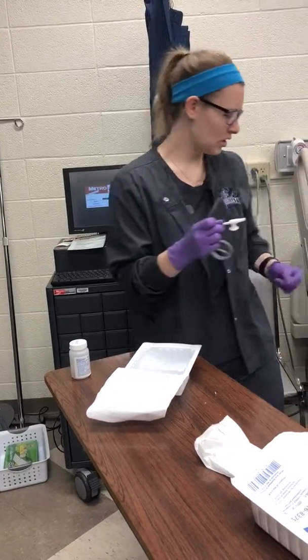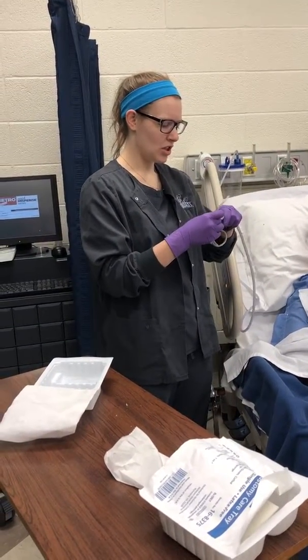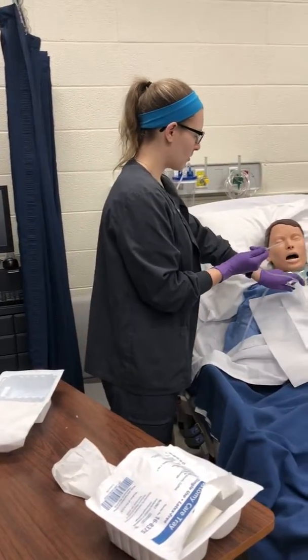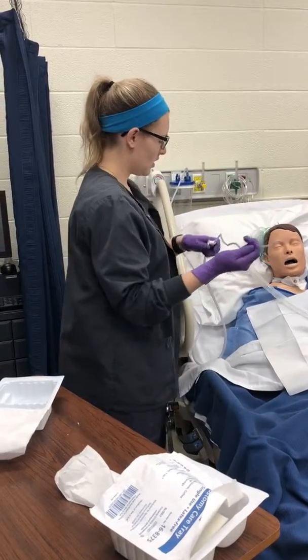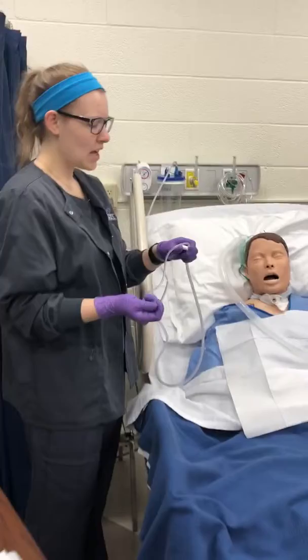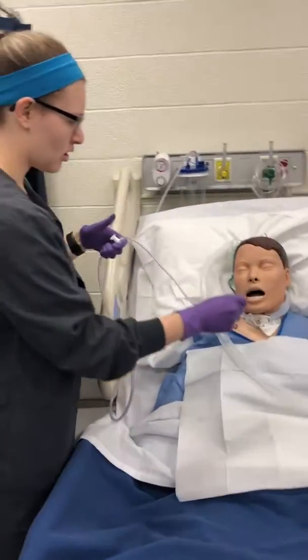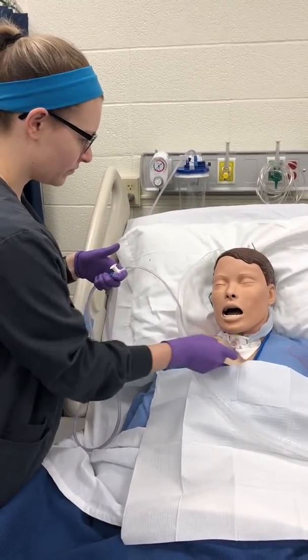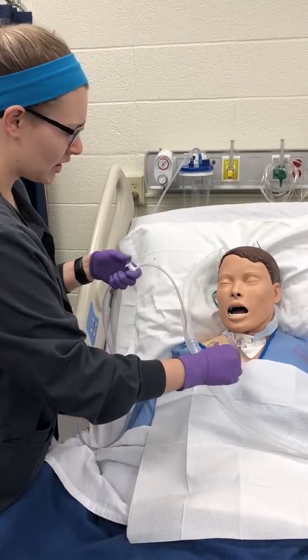I'm going to attach this to my suction and then remove the oxygen from my patient. Whenever I'm going down into the trach, I want to make sure that my thumb is off of this. So on my patient, okay, we're going to go down. And then as you come up, twist and turn and intermittent suction.